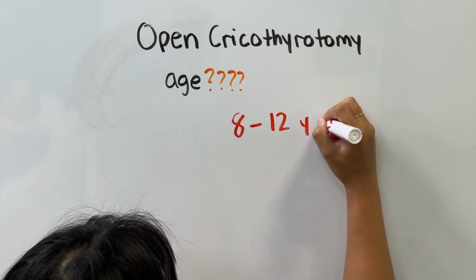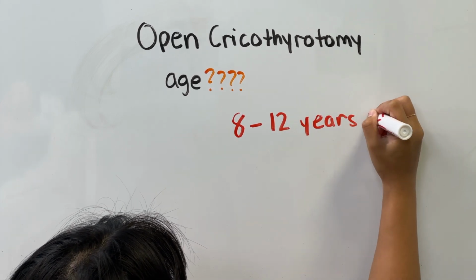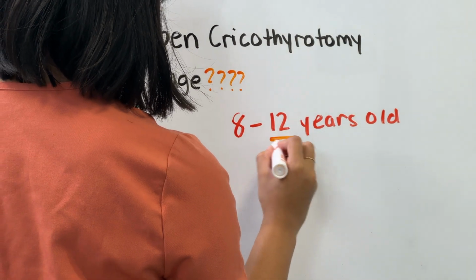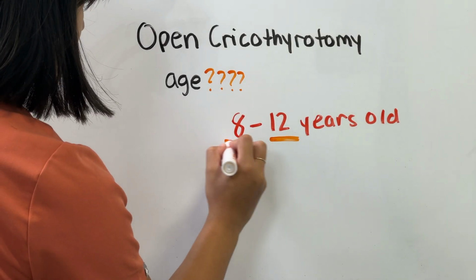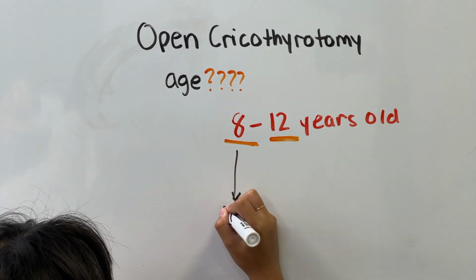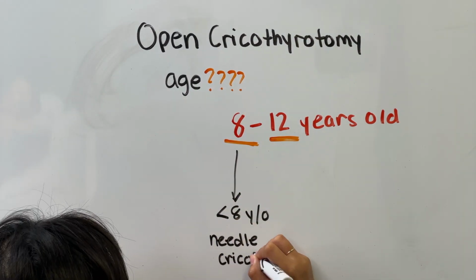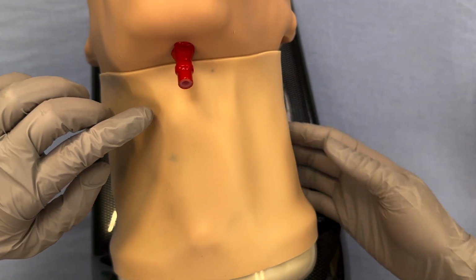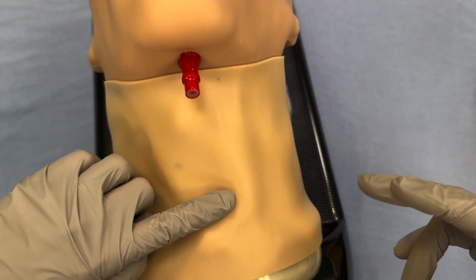That's when the space might be big enough to pass an actual tube, and you wouldn't have to settle for the catheter. The most conservative approach is to use age 12 as your cutoff, but most sources agree that under age 8, you should really be doing a needle cricothyrotomy as your surgical airway of choice. If you're unsure, you can always palpate the external anatomy to see if it feels like there's enough space, or you can perform a needle cricothyrotomy.